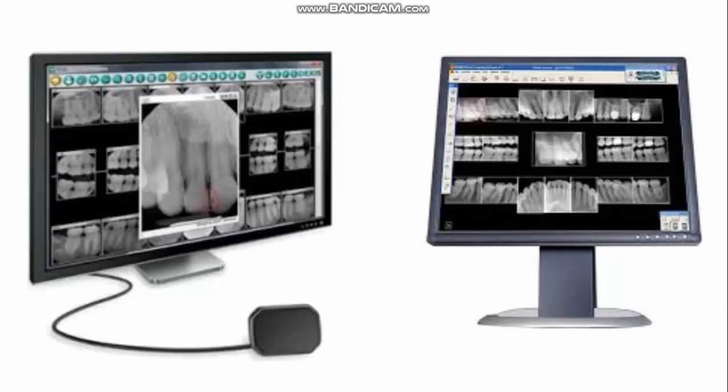One of the advantages of dental images is digital storage and progress tracking. Digital X-rays also come with the added advantage of being easily archived in the patient's digital file to be reviewed instantly at any given time.